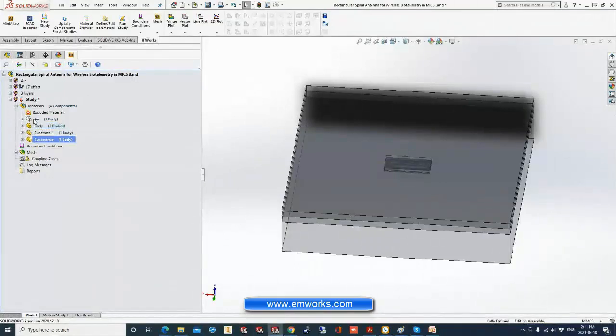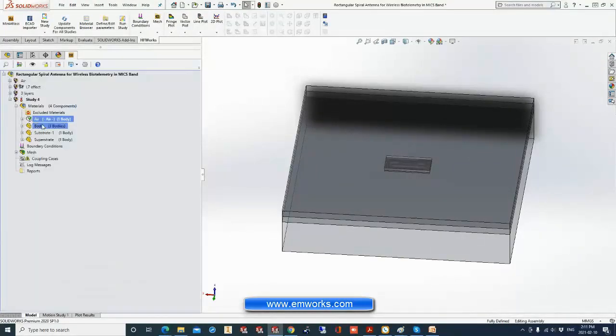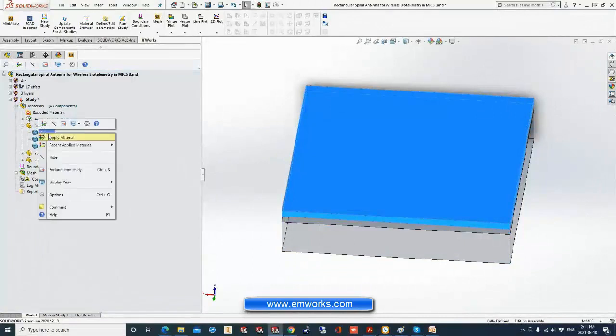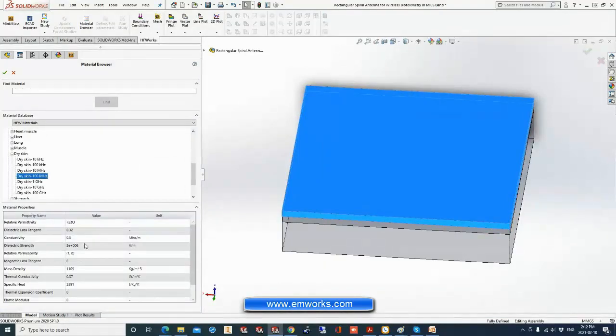We just right click on the part and apply here from HFWorks material. We have hundreds of materials classified by category or by supplier. For example, for the air, we can simply assign air. For the body, we have three bodies. So for the skin, for example, we can come here to biological material, go to dry skin, and choose the right material.